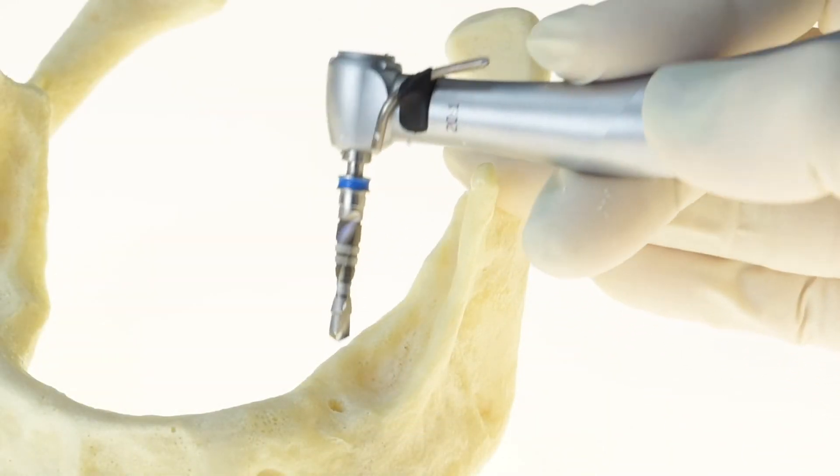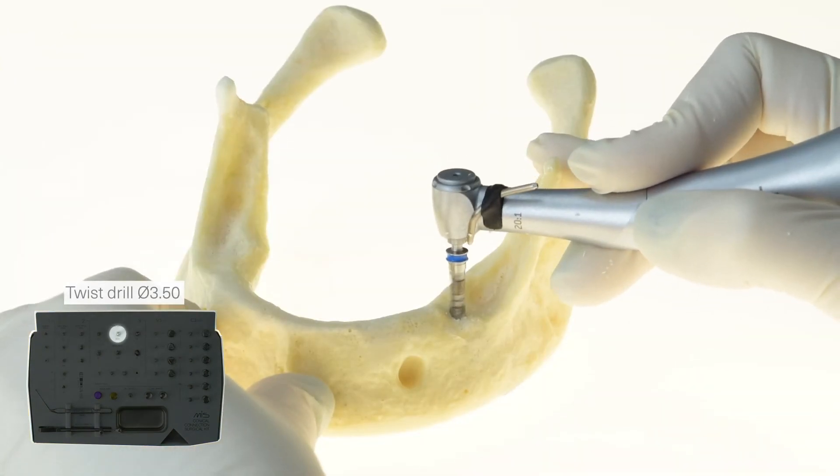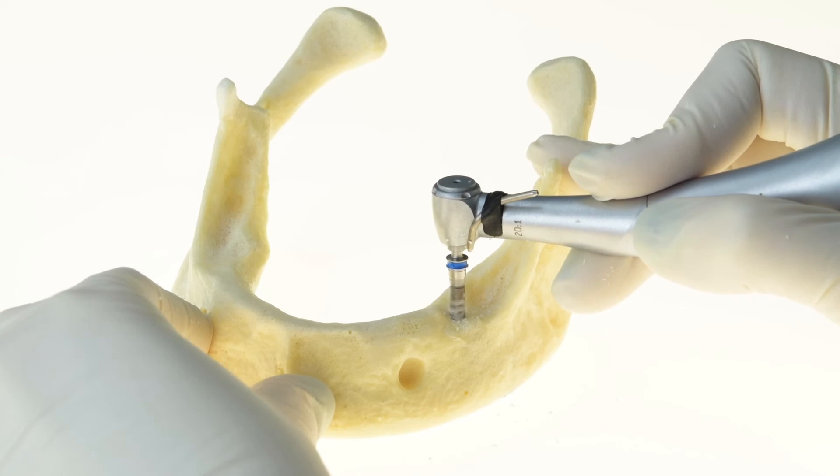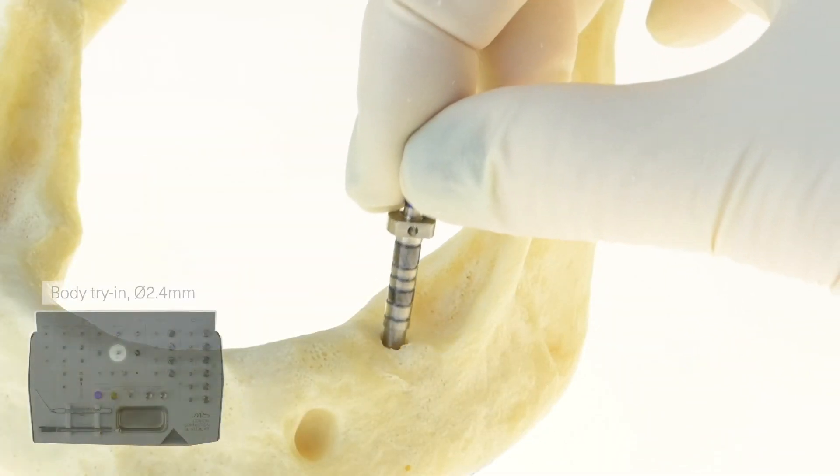A second step drill is used to widen the osteotomy. Once again, we check our depth with the body try-in.